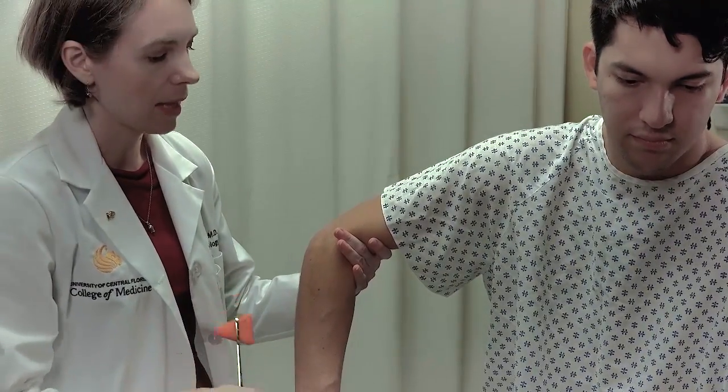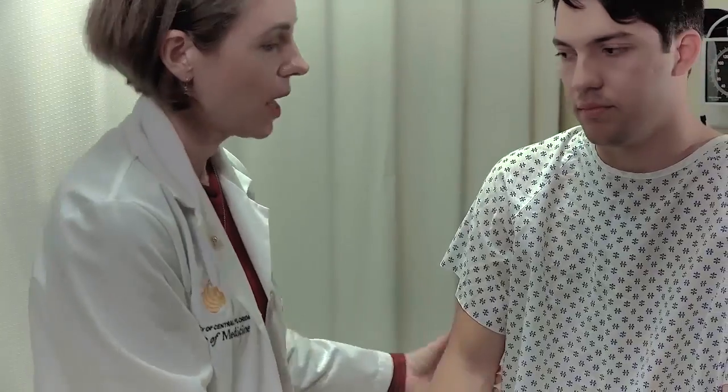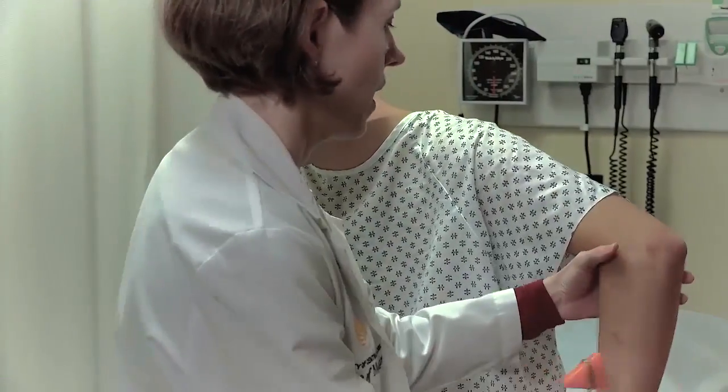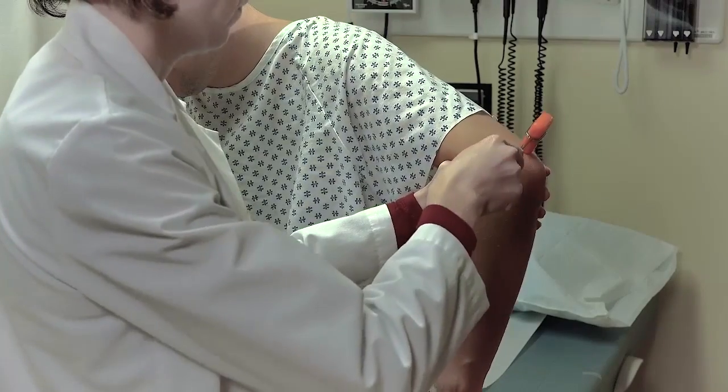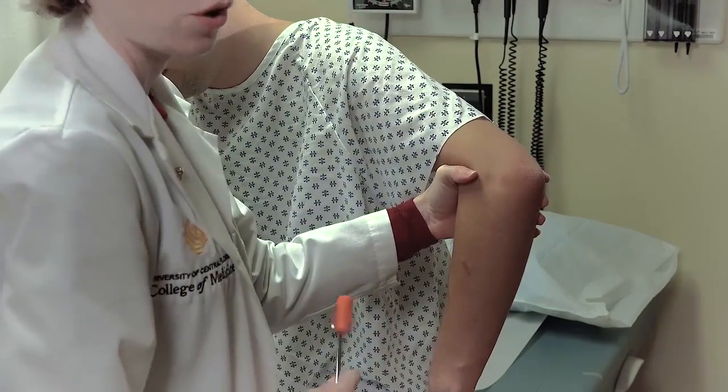You'll notice a slight swinging of the arm out laterally when the tendon is struck. Make sure you do the same thing on both sides — just relax the weight into my hand. You'll notice the slight jerk of the arm outward.